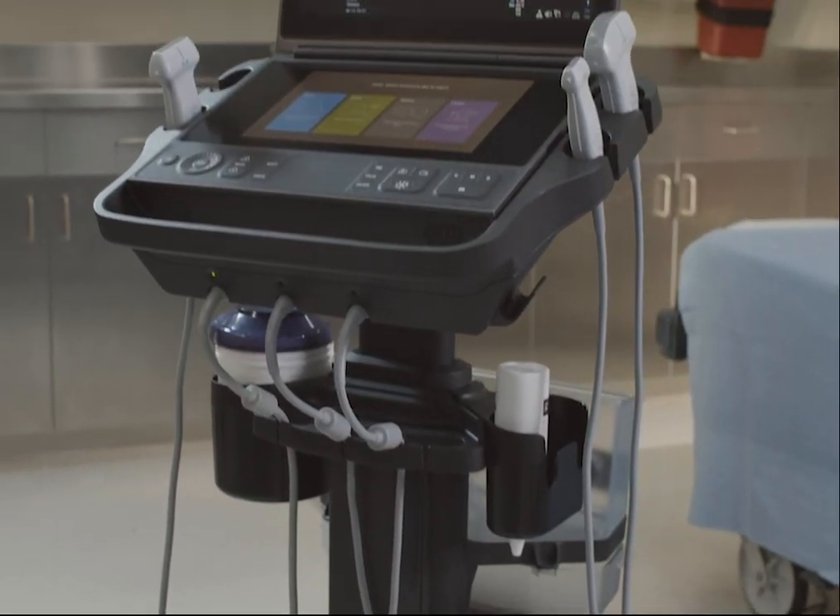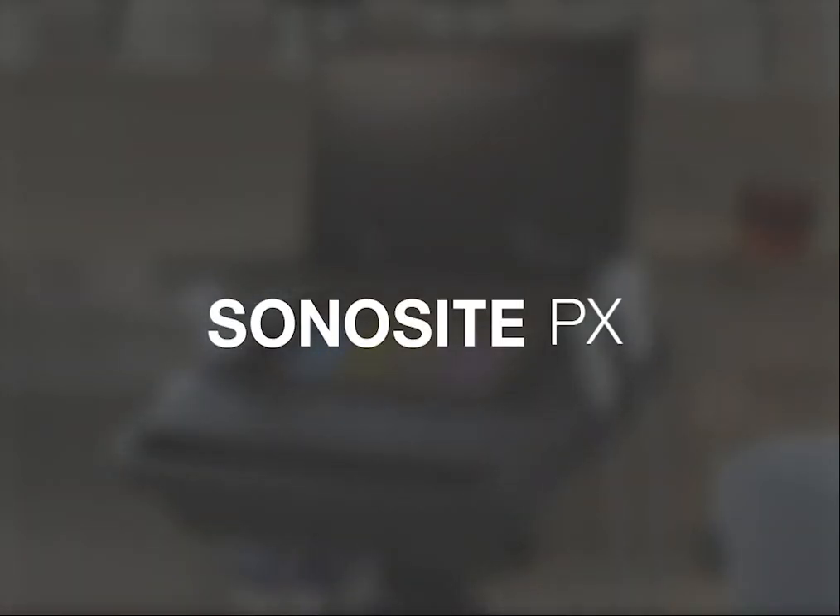For more detailed information on cleaning and disinfecting your Sonocyte ultrasound system, refer to the system user guide and the cleaning and disinfecting tool available on the Sonocyte website.